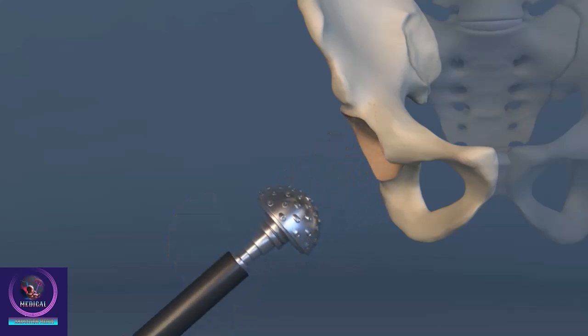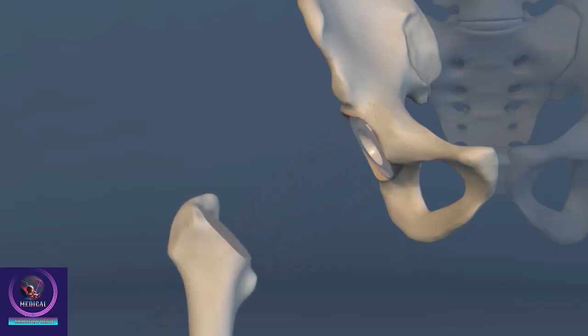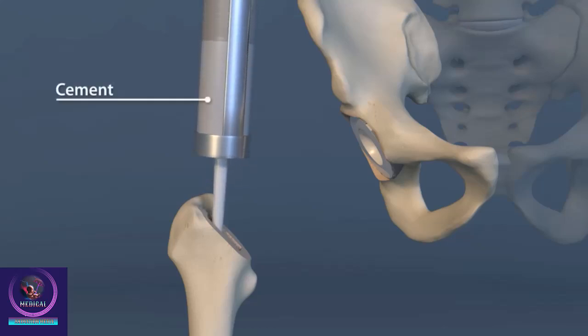A metal socket is placed into the cavity. Bone cement or screws may secure it in place. The surgeon presses a liner into the socket. The liner creates a smooth surface that will allow the joint to move freely.